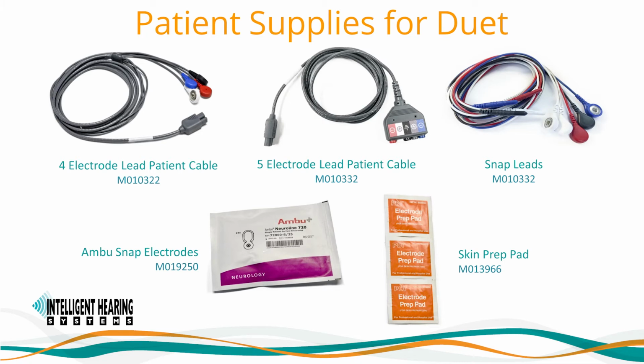Now let's review the patient supplies. Skin prep pads are used to prepare and clean the skin. If you need to reduce impedance, you would use the skin prep pad to re-clean the skin. Pat dry the skin after use.